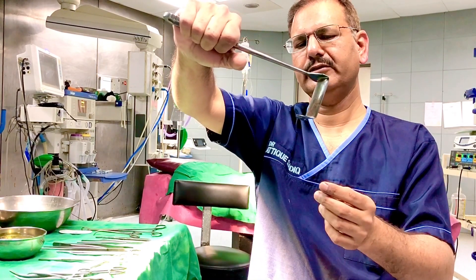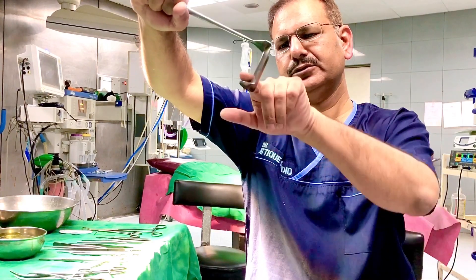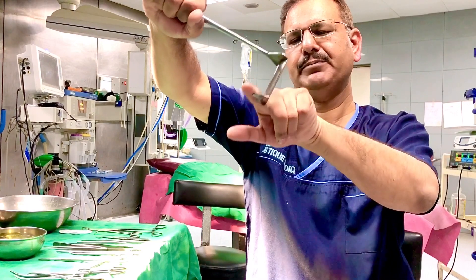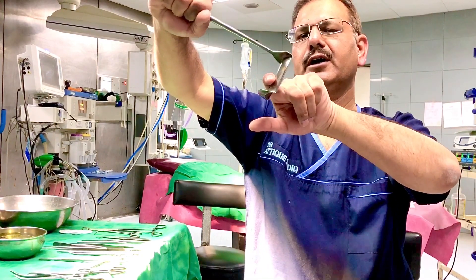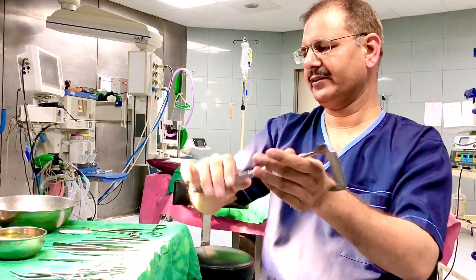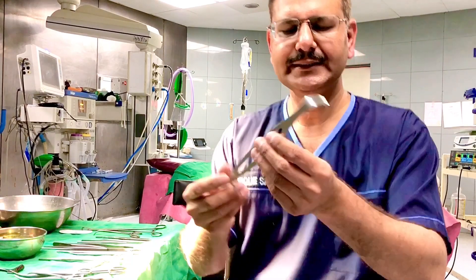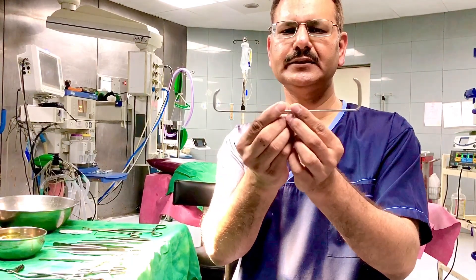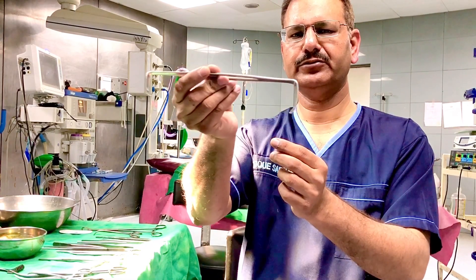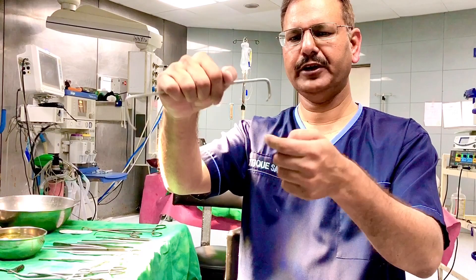This is a Morris retractor — by its structure you can see it is designed to support the tough abdominal wall so that while applying force the wall does not slip down. It is used to hold the abdominal wall. This is a US Army retractor, used for retraction of soft tissues and can be used to retract from both ends.